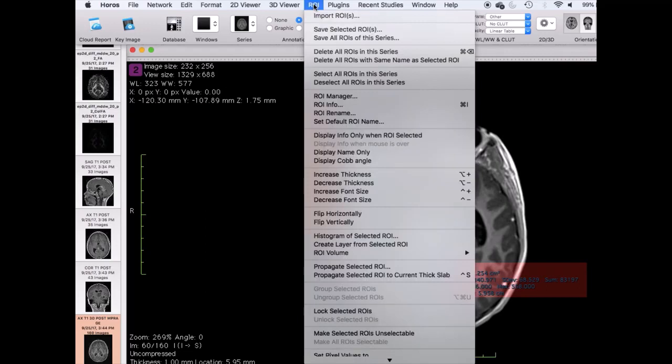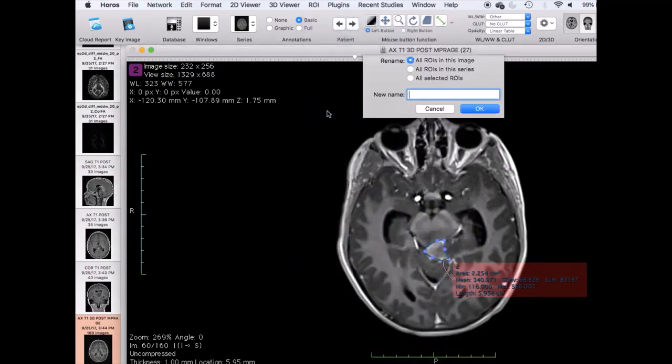After this, you will need to rename all ROIs to the same identifier. This can be done by selecting ROI, ROI rename, and selecting the bubble all ROIs in this series. Type in a name or number of your choosing.